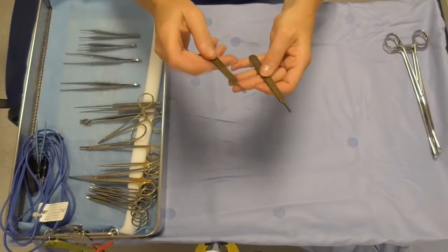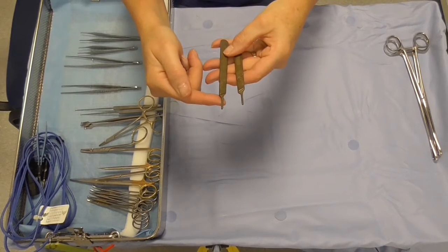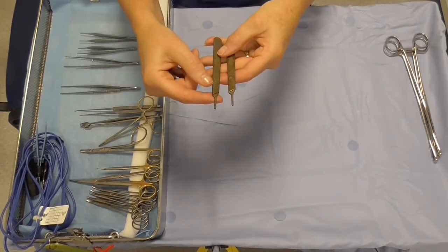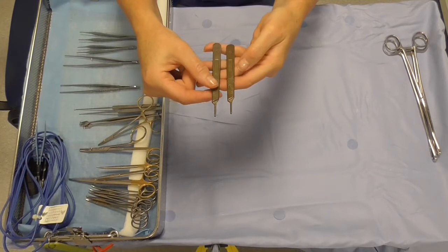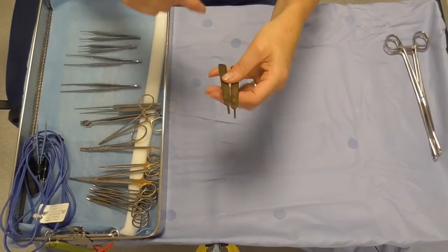Here we have the BP handles and on here we load the blades. This number 3 handle would load a 10 blade and you do have other sizes of handles to facilitate the other sized blades.